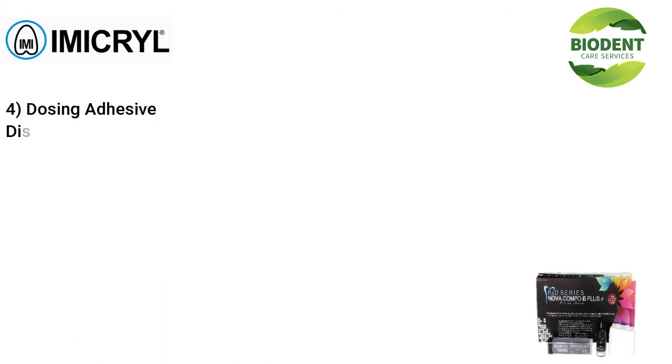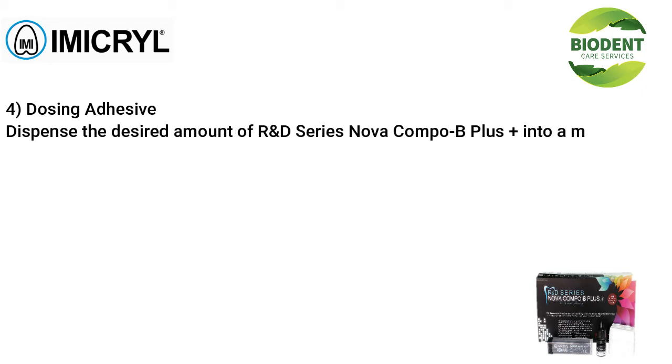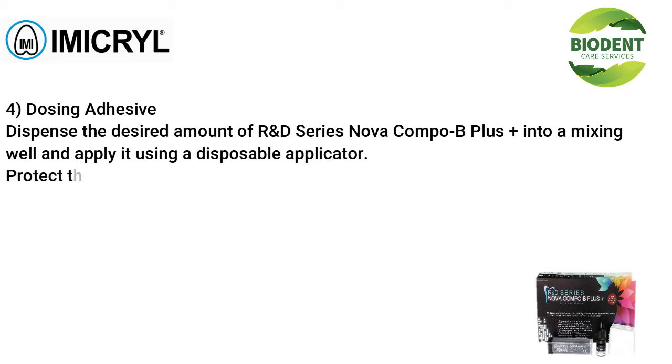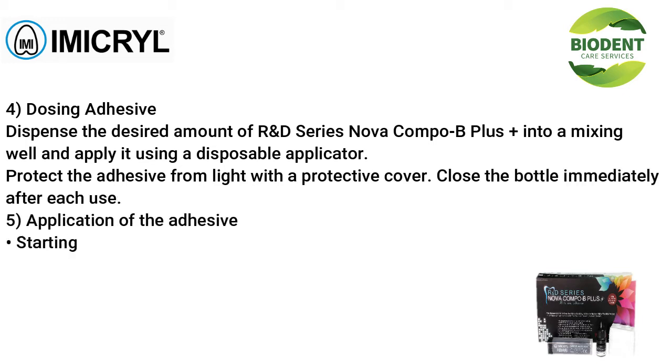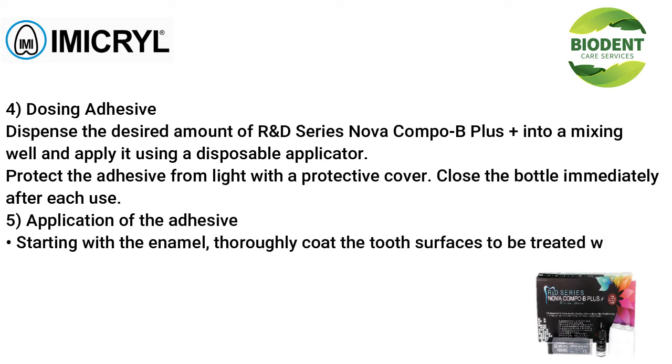4. Dosing adhesive. Dispense the desired amount of R&D Series Nova Compo B+ into a mixing well and apply it using a disposable applicator. Protect the adhesive from light with a protective cover. Close the bottle immediately after each use. 5. Application of the adhesive. Starting with the enamel, thoroughly coat the tooth surfaces to be treated with Nova Compo B+.